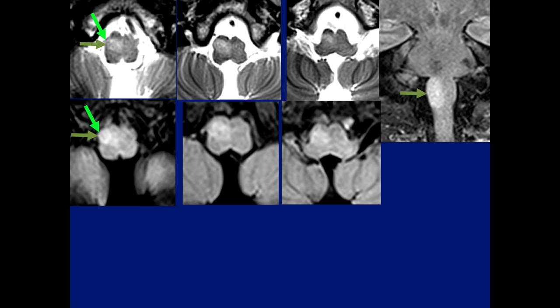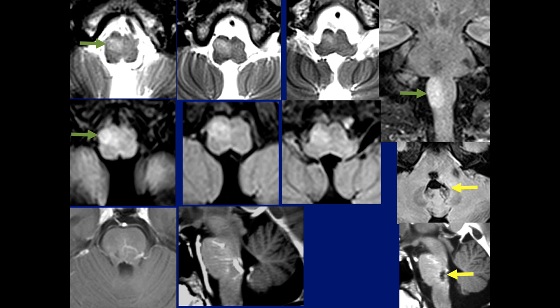Here's another case that was initially read as showing a tumor involving the olive because of the enlargement. But this was not a tumor — this was another example of hypertrophic olivary degeneration, which in this case was the result of surgery in the brainstem involving mainly the pons. This patient had multiple bleeds and evacuation of the hematoma.